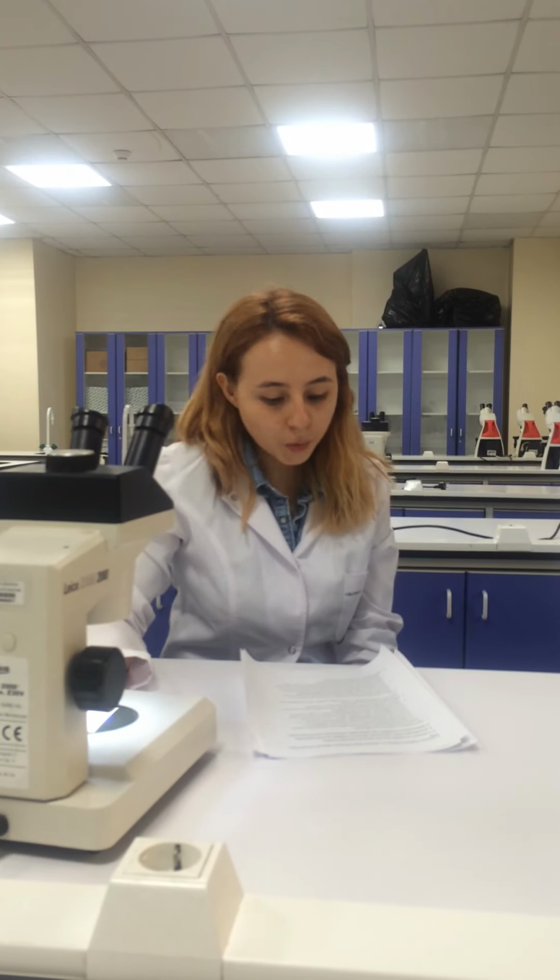Insulin stock is prepared by dissolving 10 mg per milliliter insulin in HEPES buffer, which has pH 8, and transferrin stock is prepared by dissolving 50 mg per milliliter transferrin in double distilled water, and rosiglitazone stock is prepared by dissolving rosiglitazone at 10 millimolar in DMSO. Adipose maintenance medium, with the same additions as induction medium but with omission of dexamethasone, is prepared.